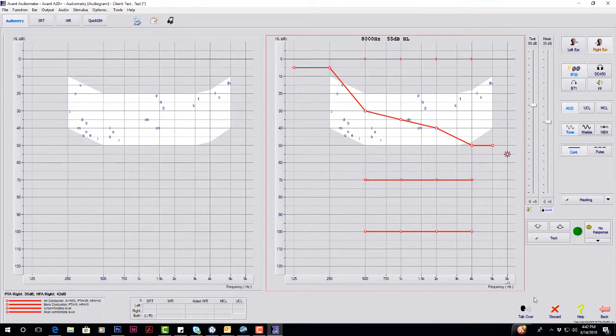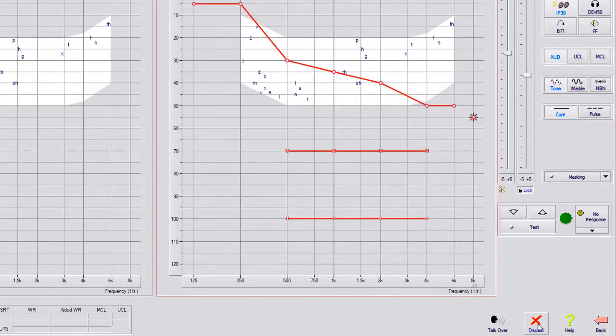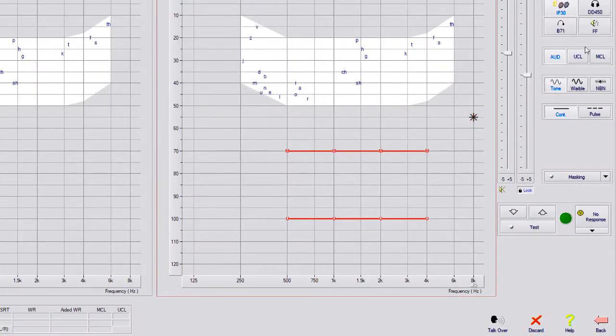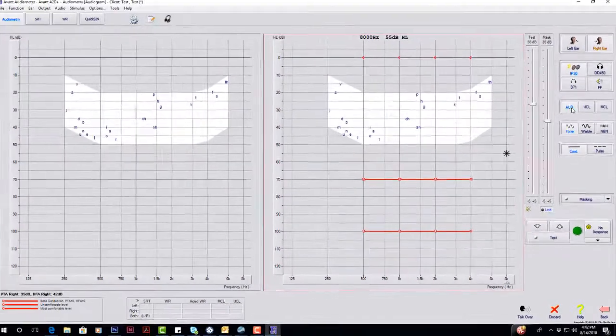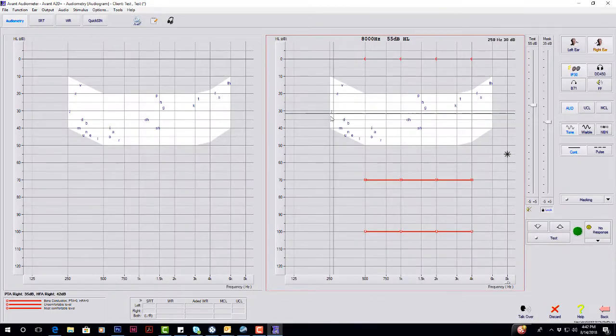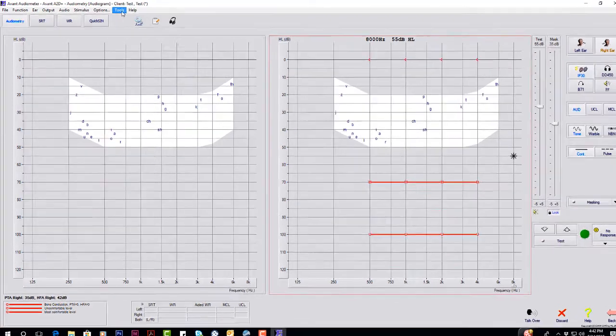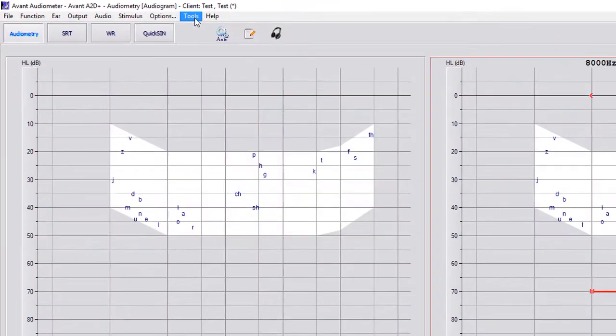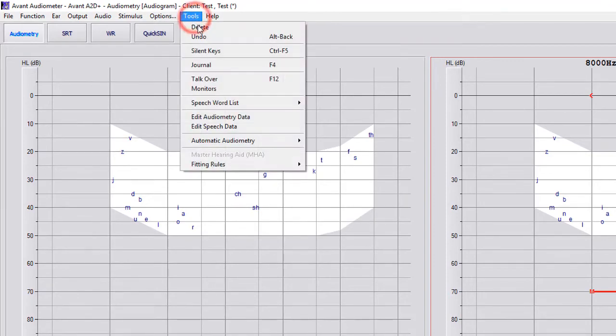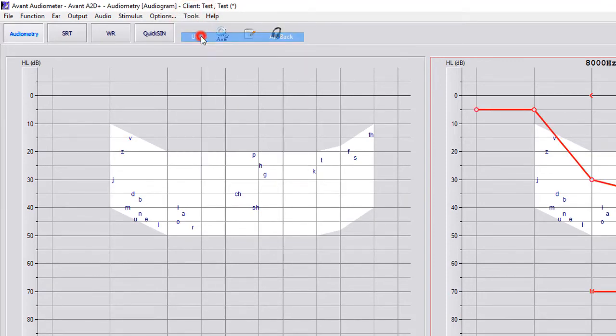To the right of talk over is discard. So you can select that and it's going to get rid of whatever test you are on. So I was on audiometry, so I got rid of that entire test. If you do delete something or you're wanting to bring something back, you can go to tools and undo and it's going to put that information back in there.